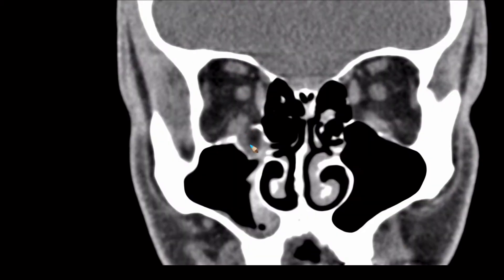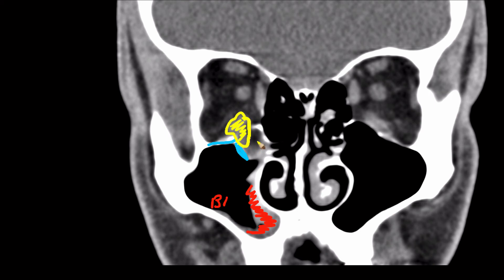Stopping on this slice and looking at the bony margins of the orbital floor, there is another depressed fracture. This time there is layering of blood in the floor of the maxillary sinus. There is also herniation of the inferior rectus muscle through the fracture gap, putting it at risk of entrapment, which can manifest as diplopia when the patient is examined.